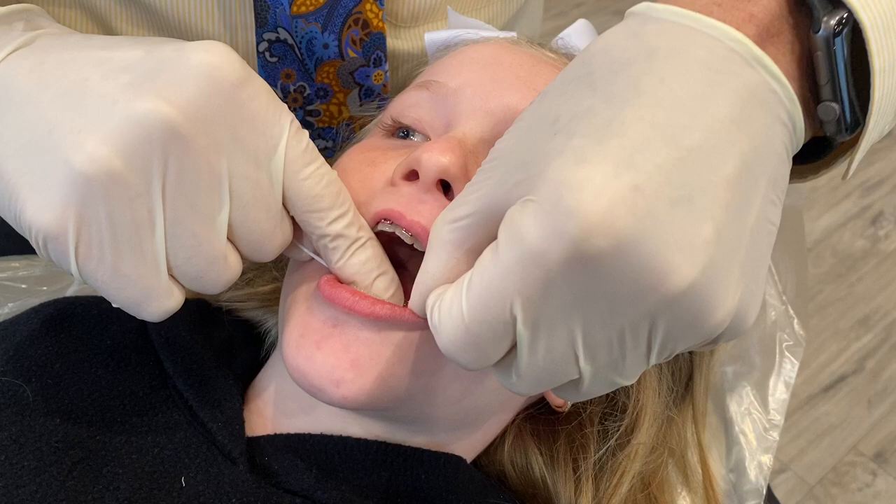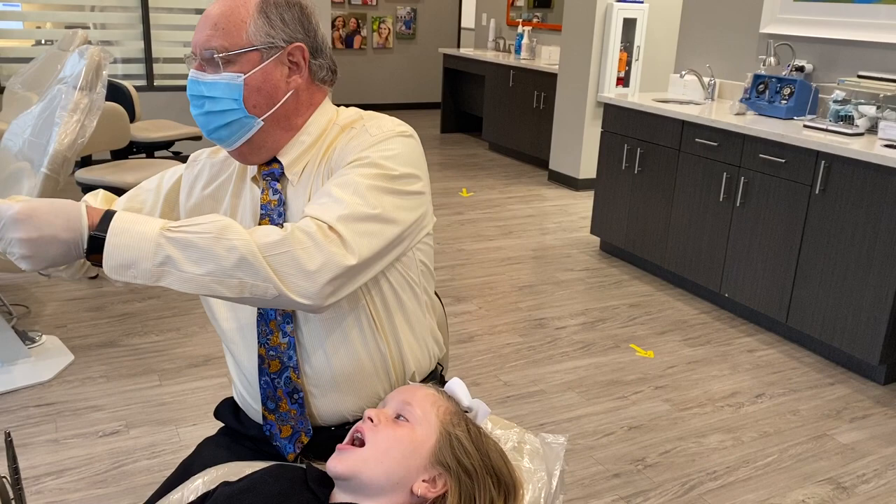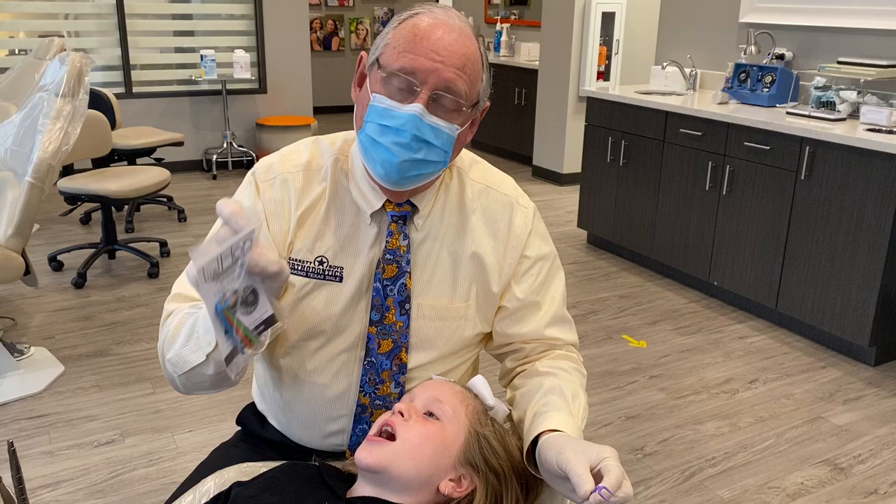We've got a product that we recommend to all of our patients called the heart flosser. They come in a package of four. You can reuse them. They last about a week apiece, so this is about a month's supply.